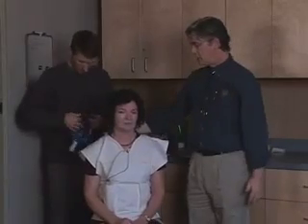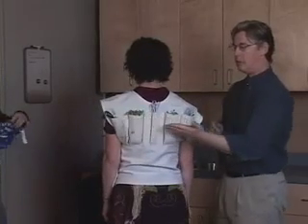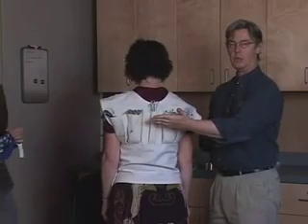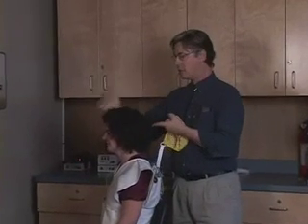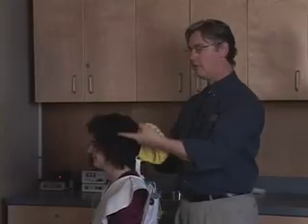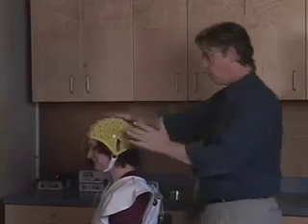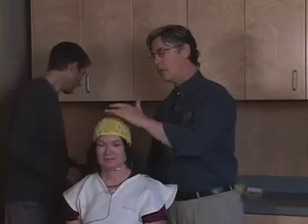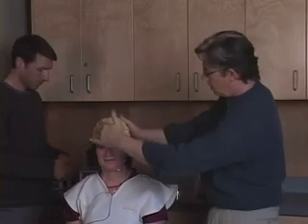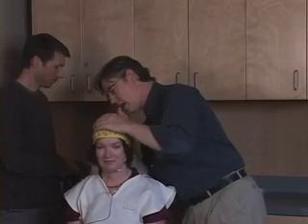Now at this point, Kate, if I could ask you to stand up and turn around, you can see how all of the electrodes that we're going to be attaching to Kate are in a very convenient location. What would typically happen is for a participant we would measure the skull size from the nose to the back of the head, and then from one jaw line to the next. And that's how we determine the appropriate size of cap. And if I could just rotate you here, Kate, we want to make sure that the center electrode positions are aligned in the middle of the head, and that we have good centering with the rest of the cap.